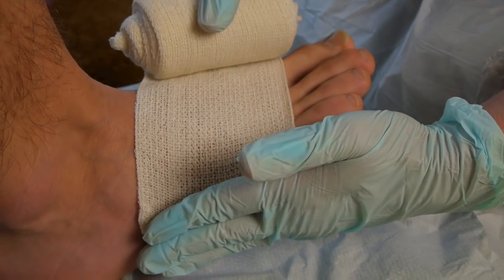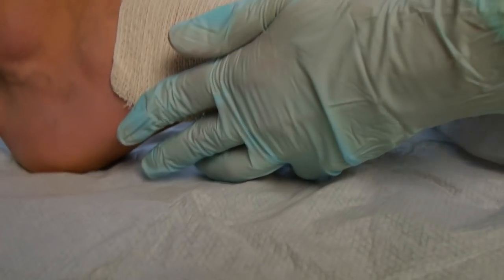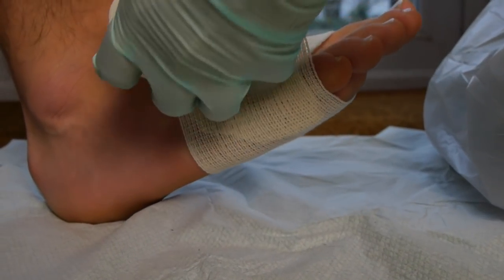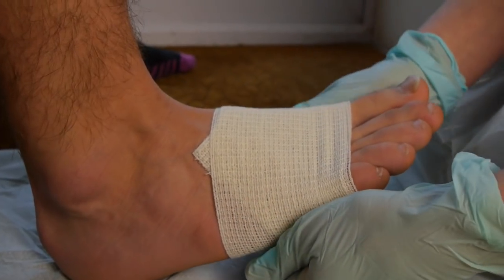Start unrolling the bandage around the base of the line of the toes. Do this twice to secure it.